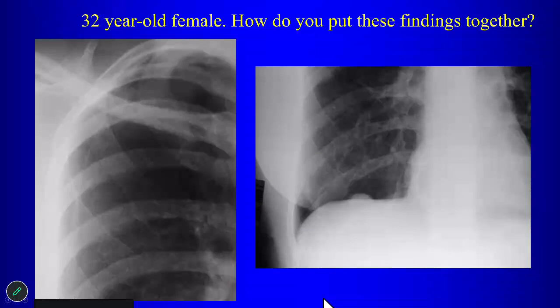Assuming that you did not do a biopsy on this patient, what could this be? Okay, so this is most likely trauma. No history of trauma. It's a young woman. Especially if the pneumothoraces are recurrent, what do you think about?